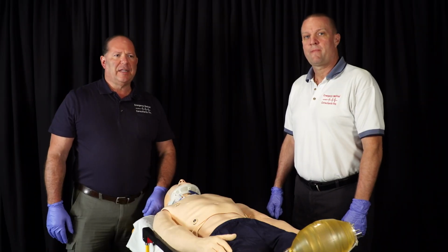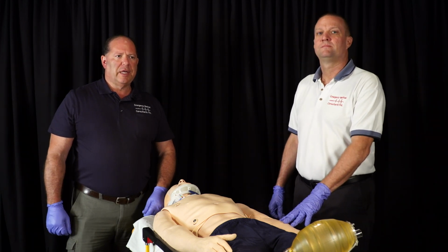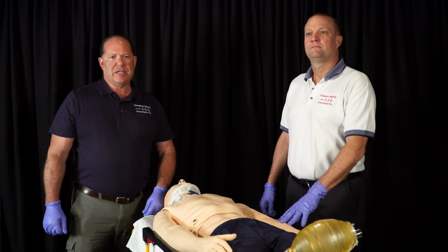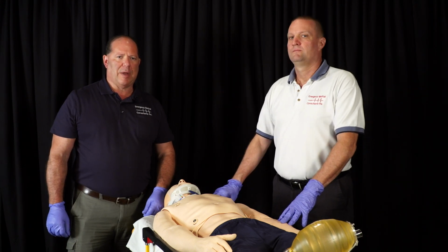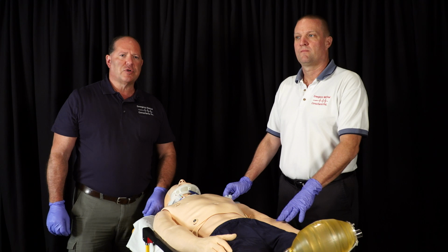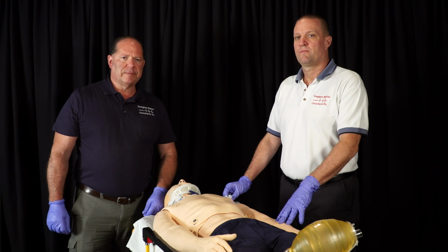So when we talk about ventilating the patient who has significant trauma, the goal is to make adequate tidal volume, that is, make the chest rise. So let's start out just talking about quick, simple, basic airway management. We know that spinal motion restriction is still considered a concern, whether or not you use a spine board.